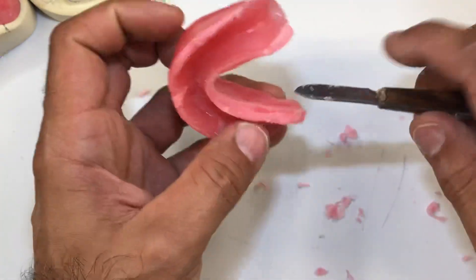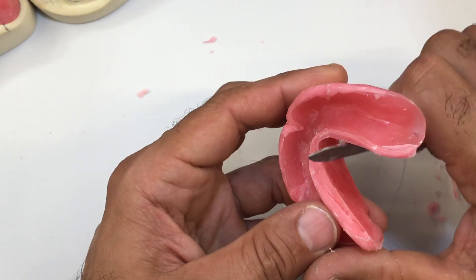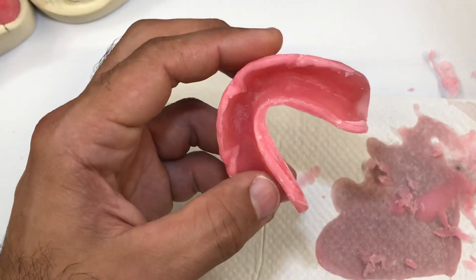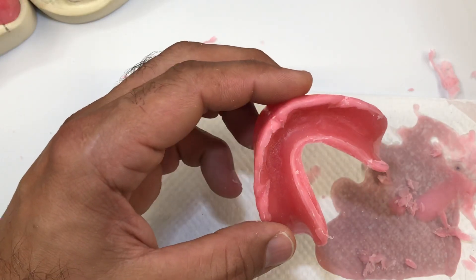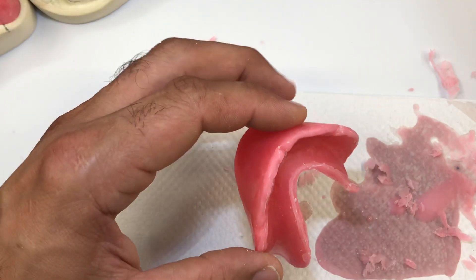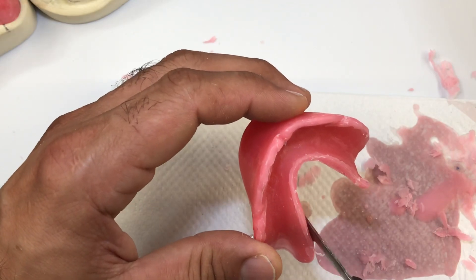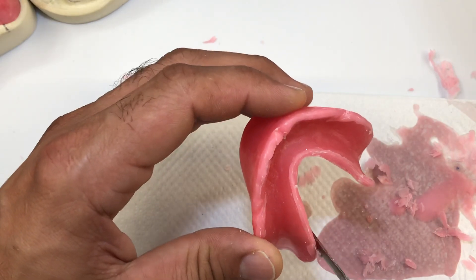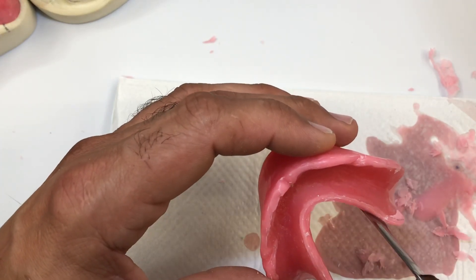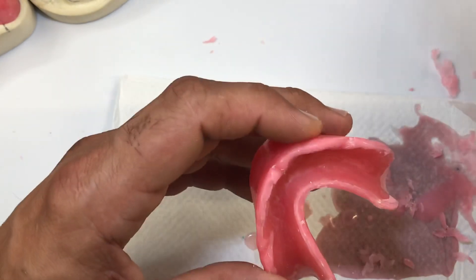Inside here there's quite a bit of an overlap over the land area. You could carve it, but you run the risk of distorting your rim. So I'm going to heat up my instrument, and away from the tissue-bearing surface — the part of the bite block that's going to contact the tissue for support — I want to make sure the wax flows away from there, so I don't get wax underneath, because it's going to alter the fit of the bite block.